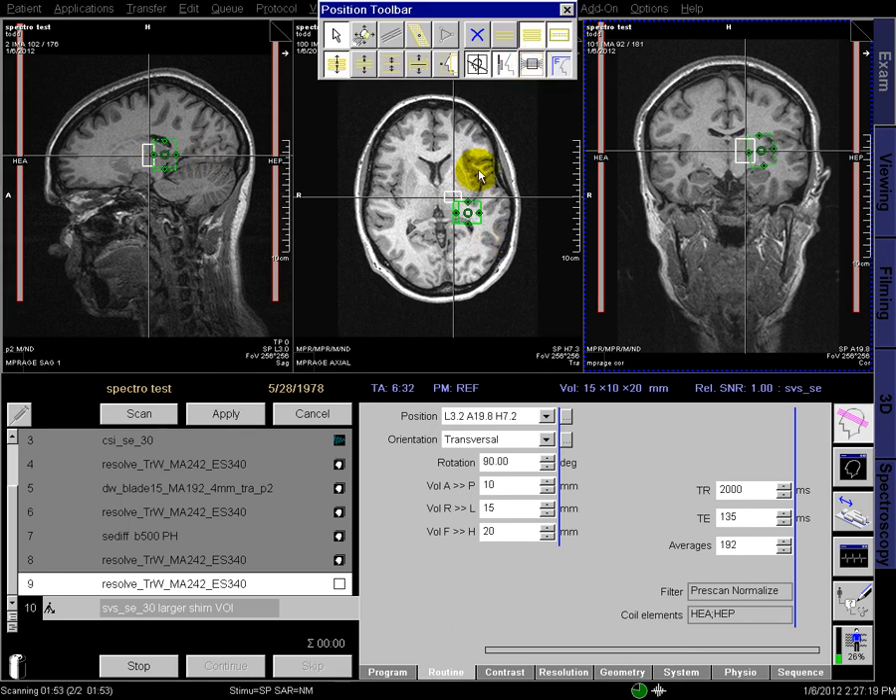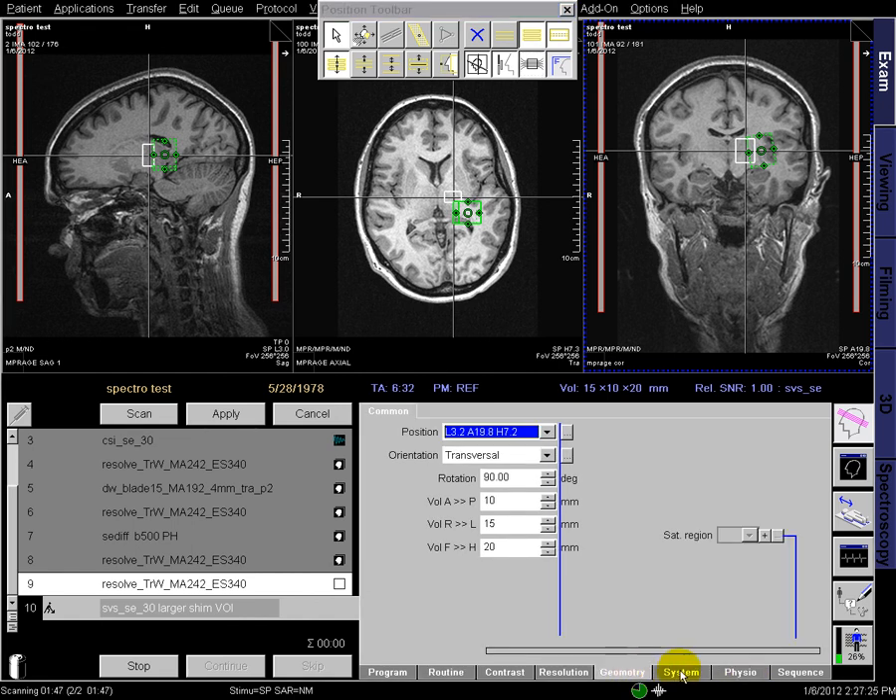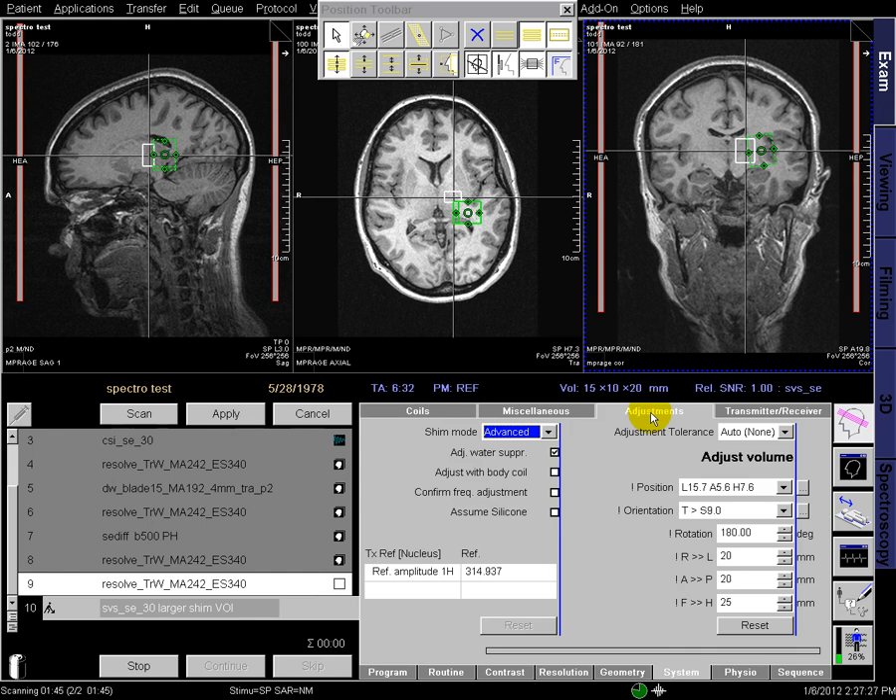To show you where the shim volume is, we can click this on, and the green box is the shim volume. Notice that it's off because I said I wanted to do this manually. You can go under the system adjustments menu and hit reset for the adjust volume, and it puts it right back where that voxel is.